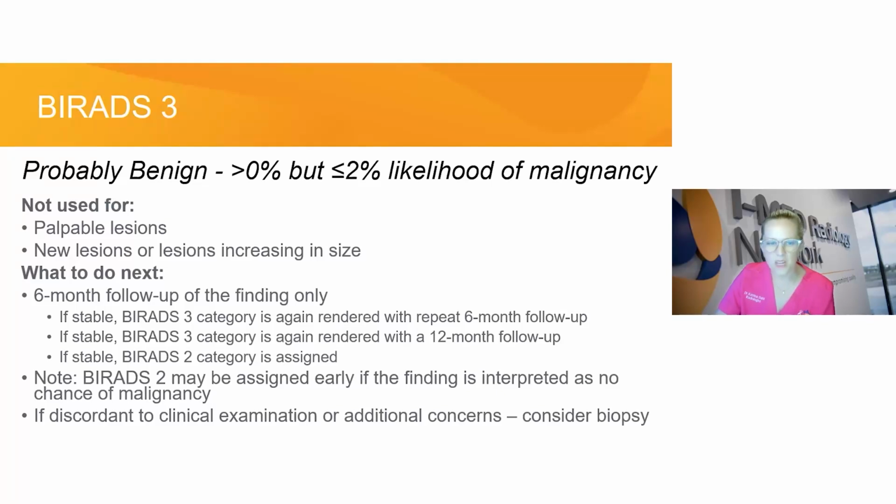Or if something changes, so we've got a solid lesion, we're at the 12-month follow-up, the woman has her mammogram and ultrasound again, and our well-defined solid hypoechoic lesion now has popcorn-like calcification, which is a benign feature of involuting fibroadenoma. It is benign, and we can stop. We don't need to complete the 2-year follow-up of that lesion.